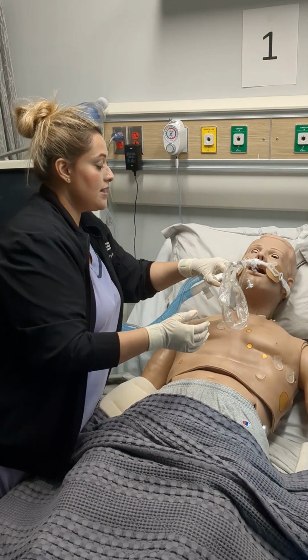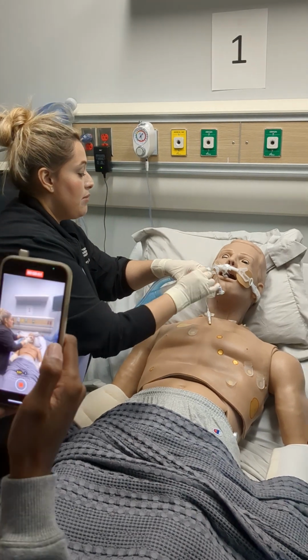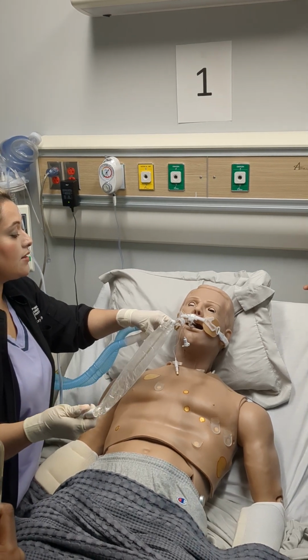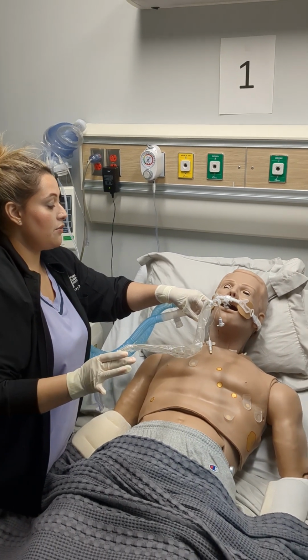So I grab it like this to stabilize it, and then I advance until I meet resistance, okay? Once I meet resistance, I pull back 1 centimeter, and now I apply suction. Okay? So that's one. This is inline?